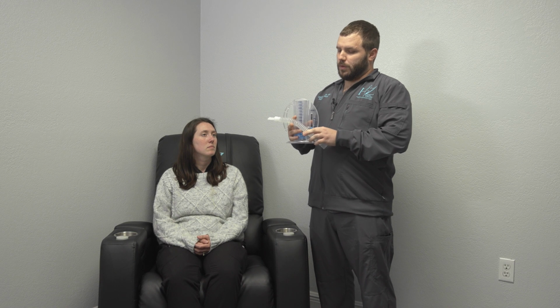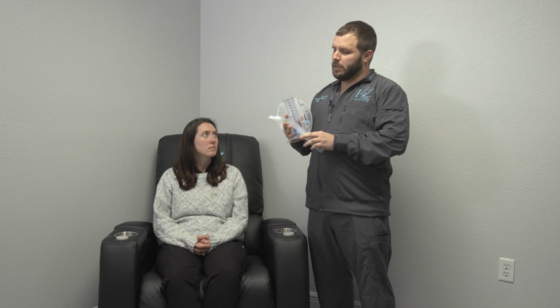Okay, in this video, we're going to be going over the incentive spirometer, how to use it, and why it's important. Most patients after surgery will receive this device. If you do not receive this device, it's just because you didn't meet the requirements for it. The longer you're under anesthesia, the more important this device becomes.